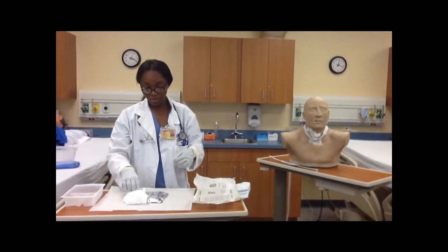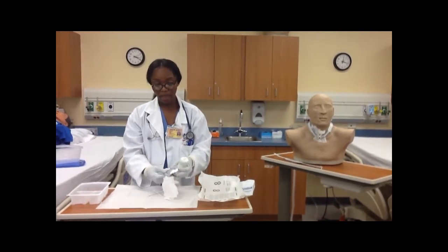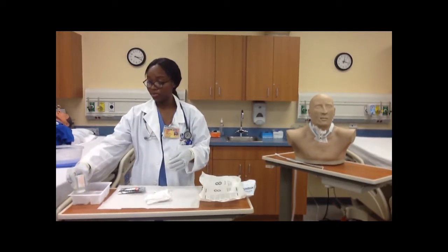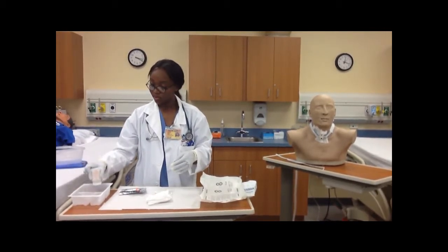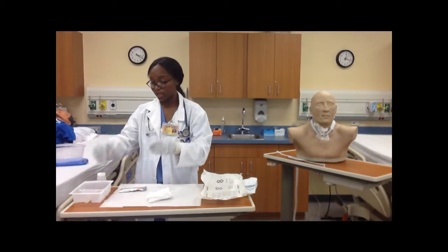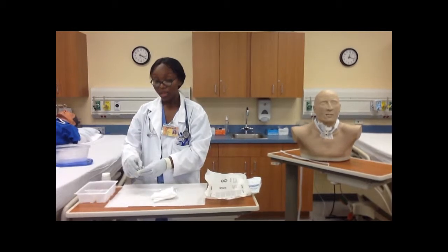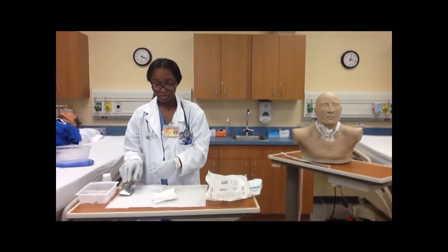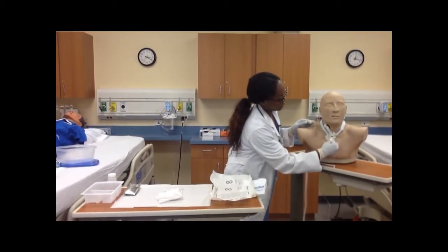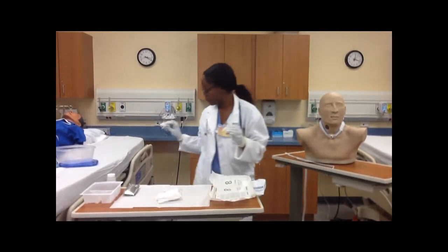Now the first thing I'm going to do is I have this sterile water here, and as well I have the hydrogen peroxide. I'm just going to pour the sterile water into all three compartments. And with the hydrogen peroxide, I'm just going to pour it into the saline water solution. That portion will be used for cleaning. Now, the first thing I'm going to do is remove the gauze from the patient, and I can throw this portion away.